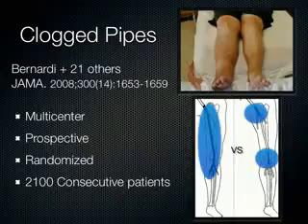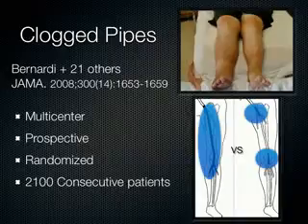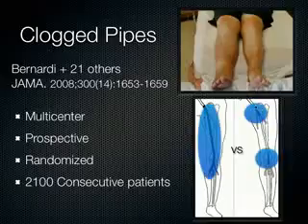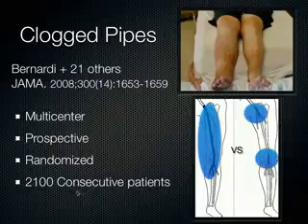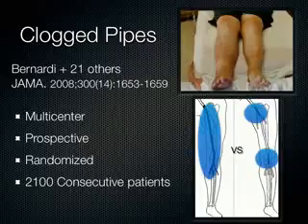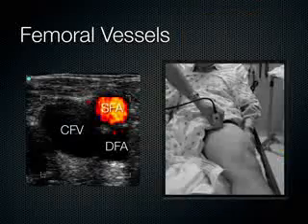And I don't know about you, but I certainly wouldn't want to be exposed to the anticoagulant if I didn't need it, especially because there's a 95% chance that I'll have a negative ultrasound. And a study was done, published in JAMA, comparing the full technique to the limited technique, which is only looking in the FEM and the POP. And there were 2,100 consecutive patients. It was randomized, prospective, multi-center. Pretty decent methods, and it turns out that there was no difference between these two groups at all. And so that helps me remain confident when I do my 2-point bedside ultrasound, looking in the FEM and the POP for a DVT. And this is what it looks like here.